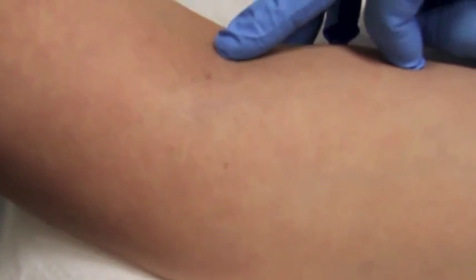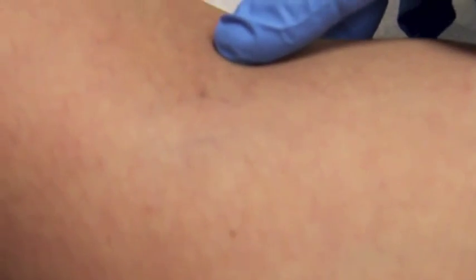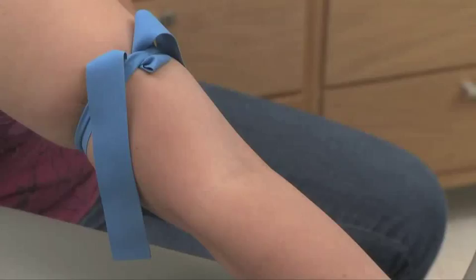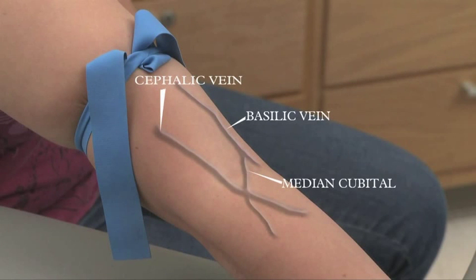The phlebotomist will examine the arm for a suitable vein in the antecubital area. If there is not a suitable vein on the first arm, then the second arm will be examined. If there is no vein suitable on either arm, the back of the hand will be examined and perhaps used.